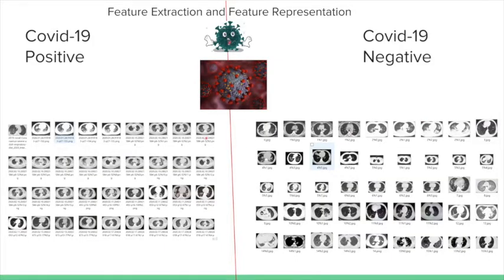And typically what our CNN is trying to do is to learn representations. This is a snapshot of our training data with COVID images, and this is it with COVID negative CT images. And we're trying to almost learn what a radiologist would learn when he or she or they are making the diagnosis that somebody has COVID-19 or not based on their CT scans. That's what our model is trying to learn.